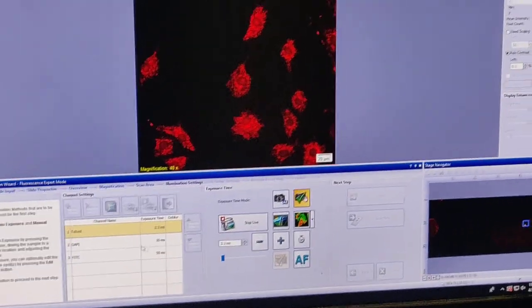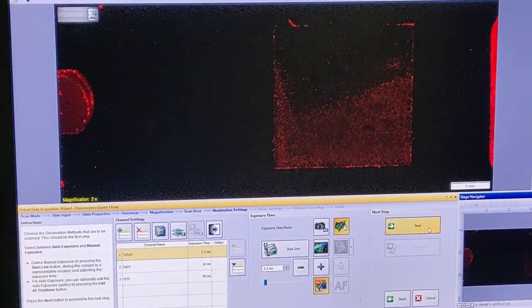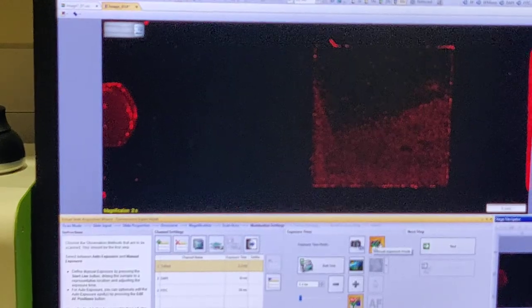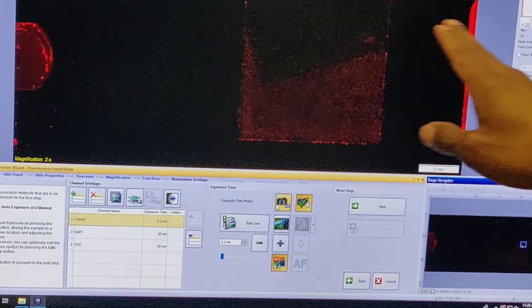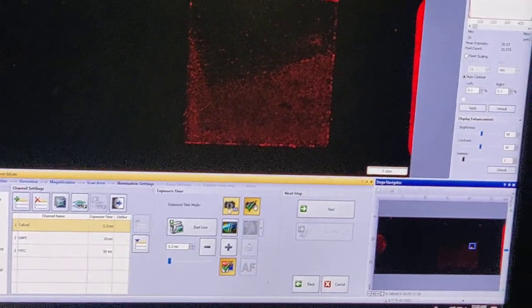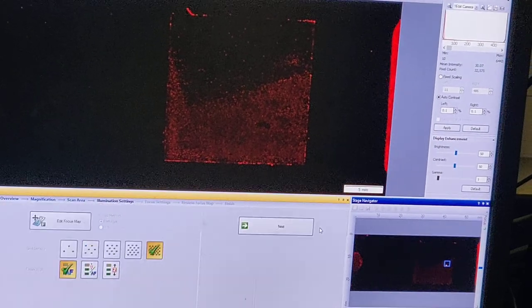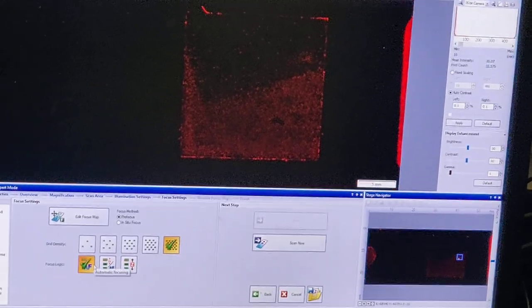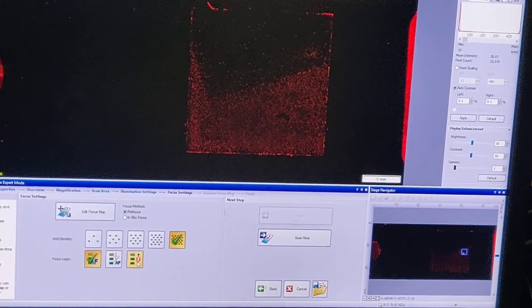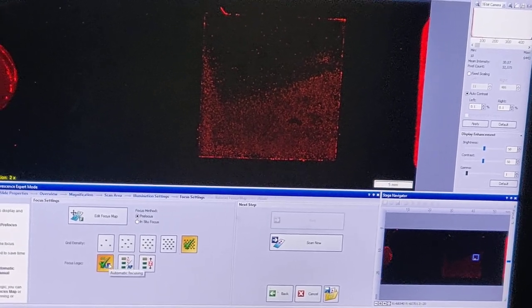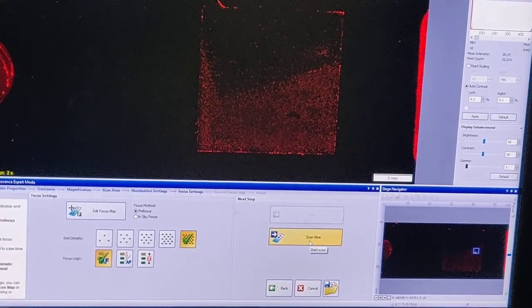Once I'm happy with the images, I stop live view. I always do manual exposure — never auto expose — because auto expose will keep adjusting until it hits a particular count target, which I don't want. Auto contrast is on. For autofocus: I can choose auto focus or manual Z focus. Auto focus is pretty good in this case. Now I'll start the scan.